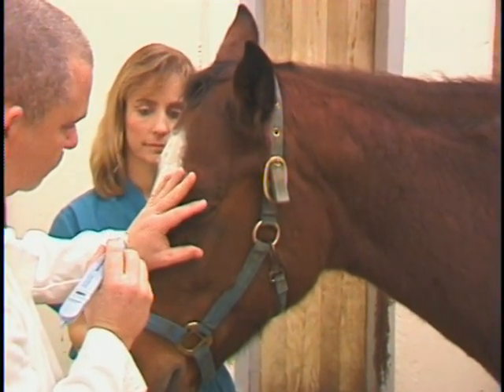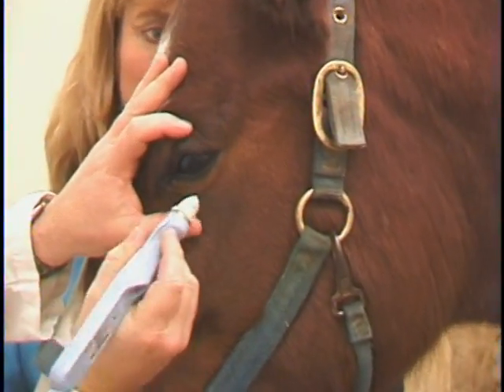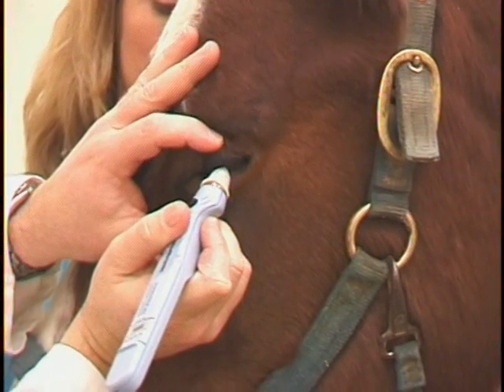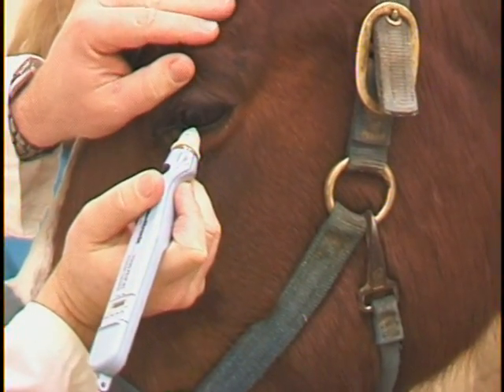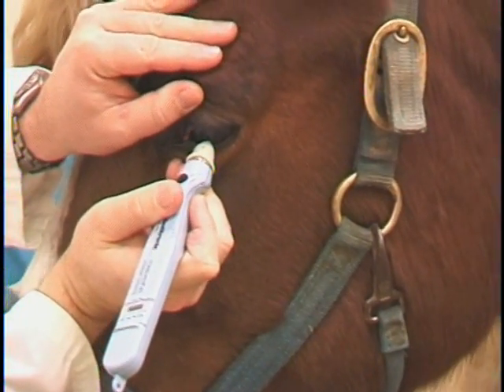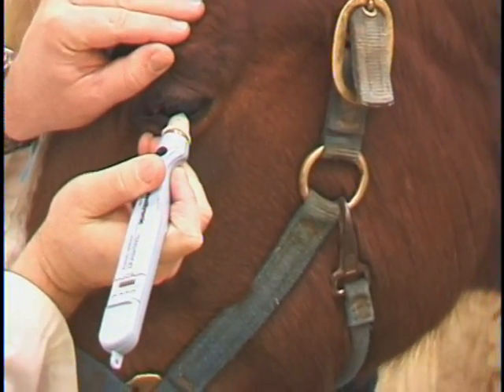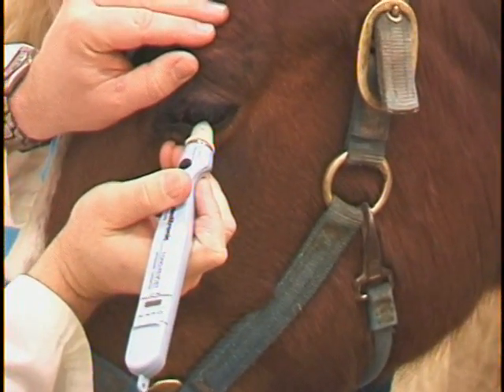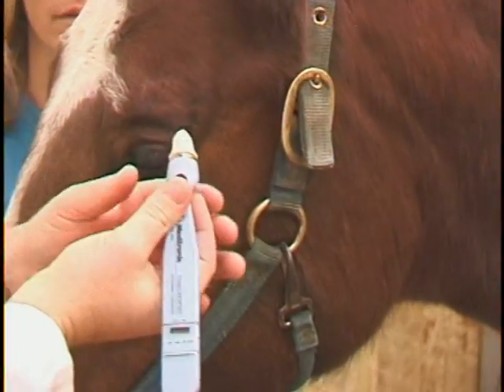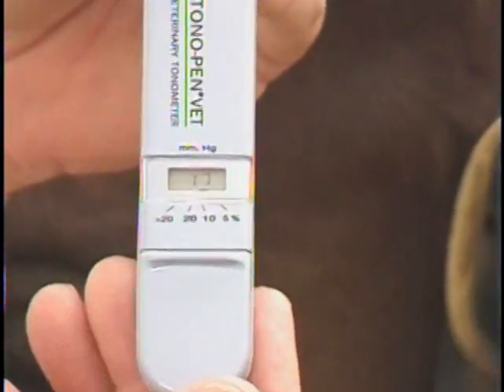Turn the Tono-Pen on by depressing the activation button for 1 second. The transducer tip is very gently tapped or bounced against the surface of the cornea. The transducer must contact the cornea at a 90-degree angle. The examiner listens for the auditory signal each time the Tono-Pen accepts a reading. The Tono-Pen will make multiple readings, average them, and calculate the standard error. The error bar should be under the 5% reading to ensure accuracy. If the error is greater than 5%, the clinician should repeat the measurements.